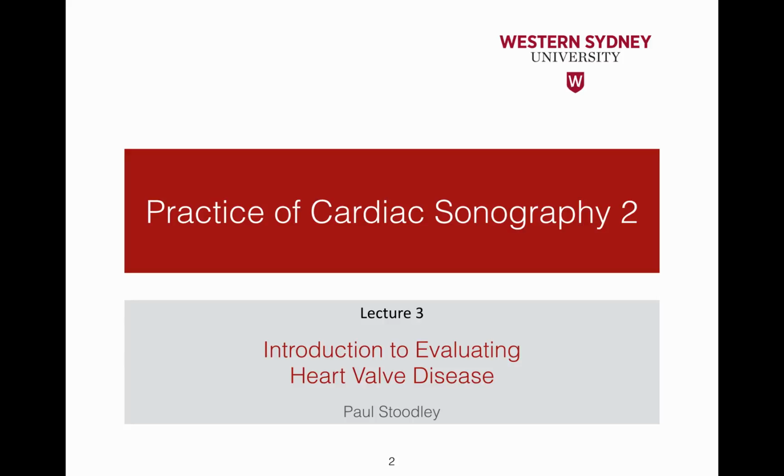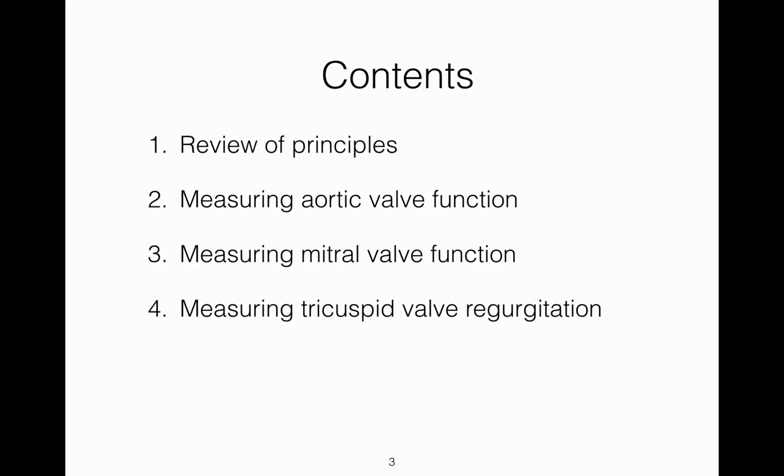In this lecture, Lecture 3 of the Practice of Cardiac Sonography 2 unit, the assessment of valvular function will be introduced. The contents of the lecture include: 1. A review of valve anatomy and function, and of the principles used to make quantitative measurements of valve function. 2. Measuring aortic valve function. 3. Measuring mitral valve function. And 4. Measuring tricuspid valve regurgitation.